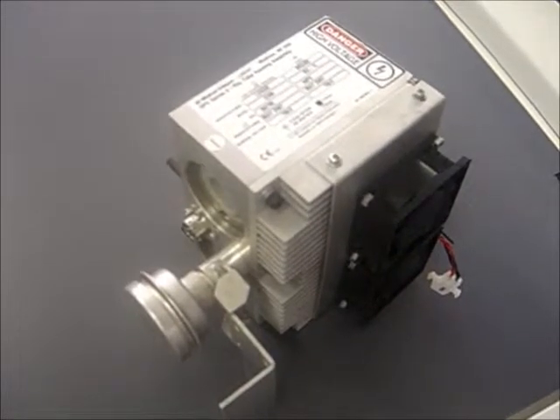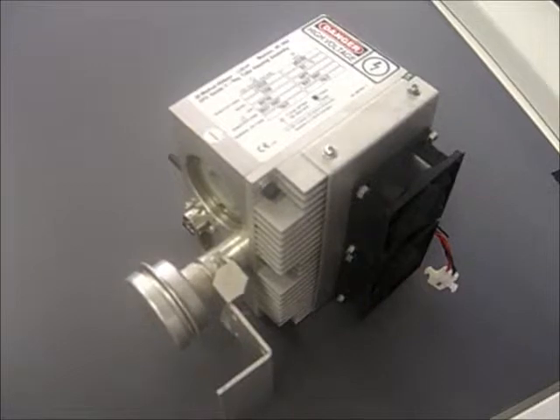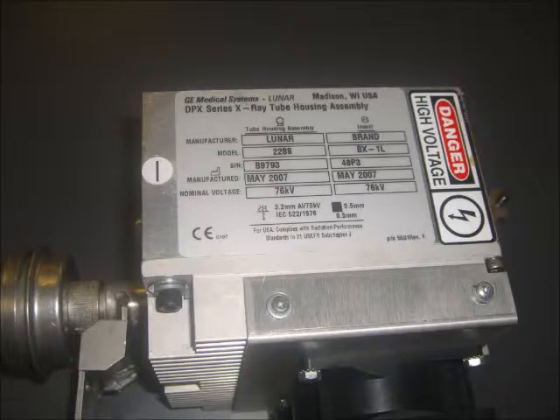The first tube we want to discuss is the DPX Series IQ, model number 2288. To find the model number of your tube, please reference the tube ID tag and look in the upper left hand corner.